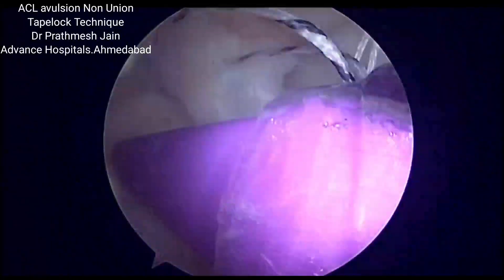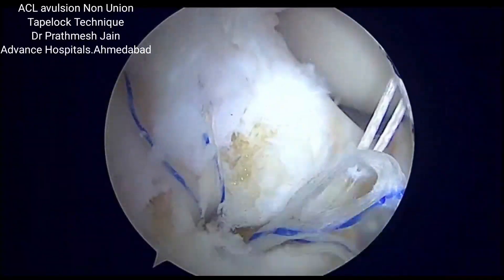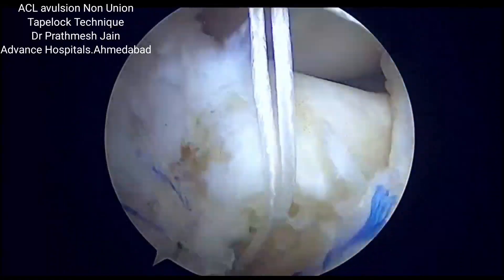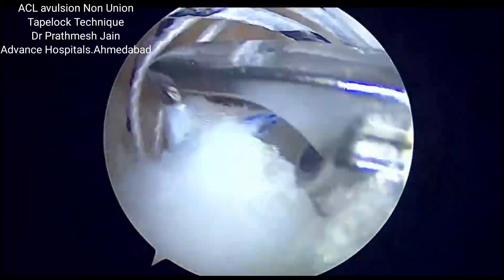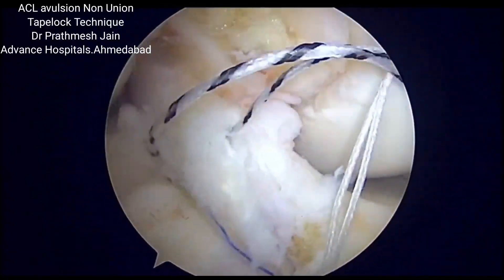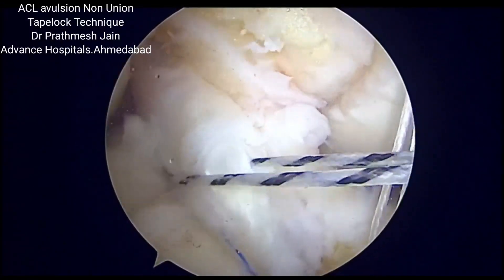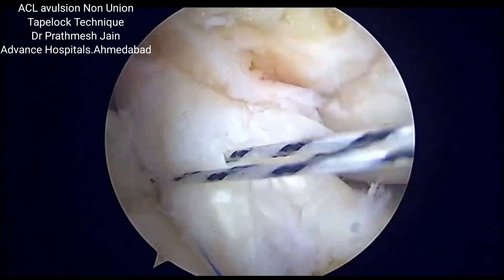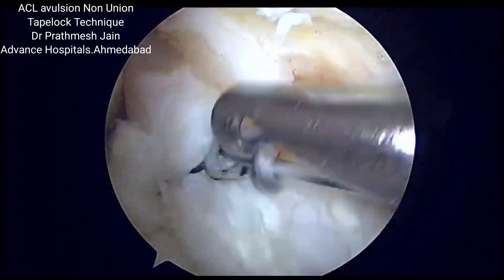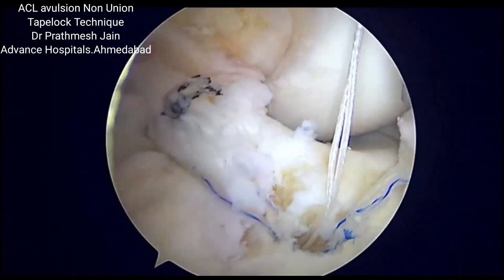We will be tying the sutures which have been passed as an adjunct to increase the surety and safety of the construct. The tapes are cut and the two fiber wires are now tied over the stump. These fiber wires are tied as an adjunct to fix the ACL fragment back into the crater. Once done, a very strong construct of tape lock anchor with double row fixation is achieved, with good stability and potential for bone-to-bone healing.